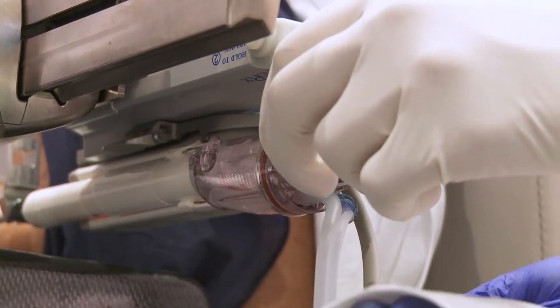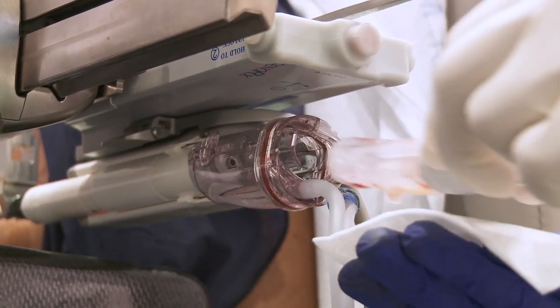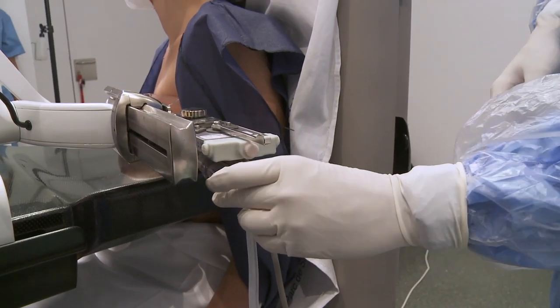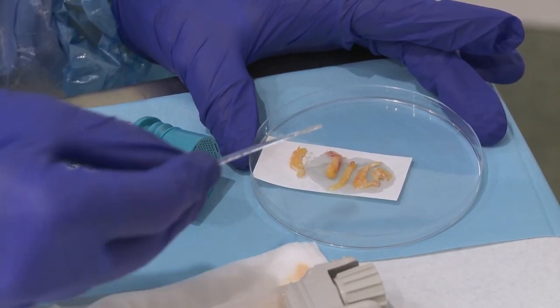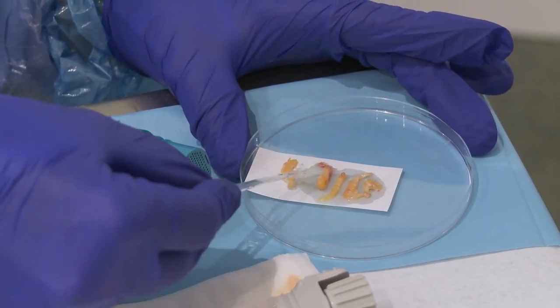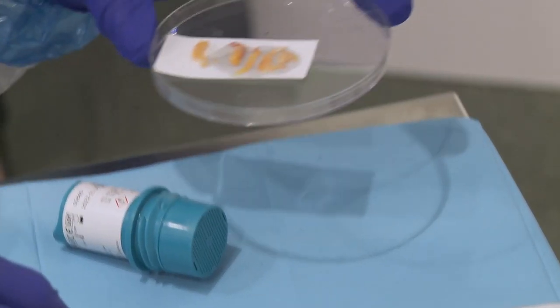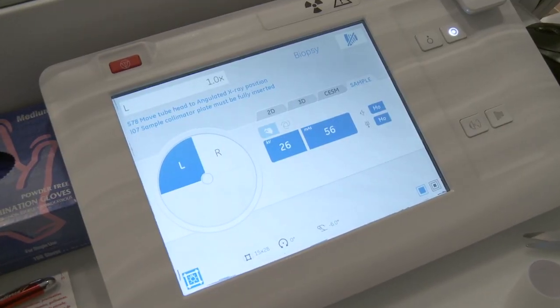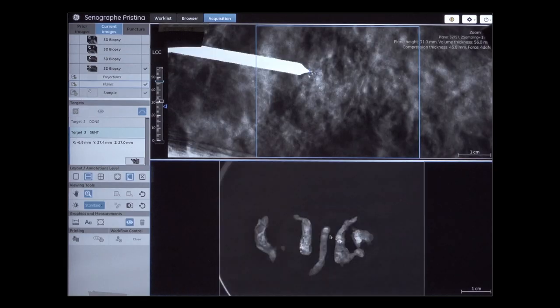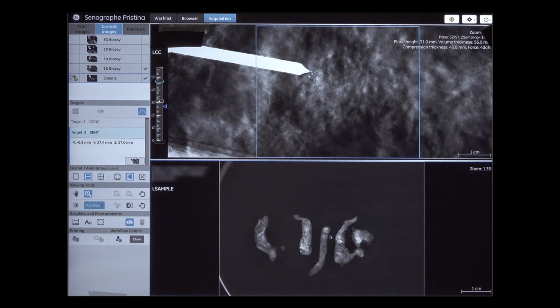Samples are retrieved with automatic rotation of the probe according to the pattern selected. Remove the sample basket and insert a new one if needed. Select sample mode in the X-ray console. An X-ray image is taken of the samples collected to check whether micro-calcifications are included. The samples are representative — no further sampling required.